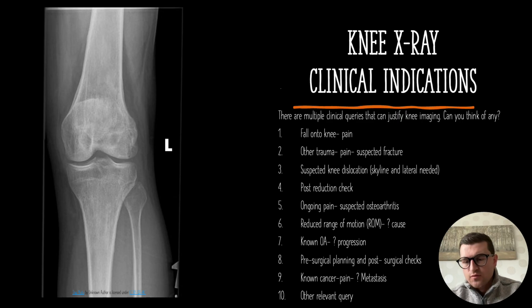And if someone has a known cancer diagnosis elsewhere, they've maybe got femoral pain and they're maybe wanting to rule out a MET in the distal aspect, so a knee radiograph would justify this as well. And of course, as I said earlier, any other relevant clinical query.